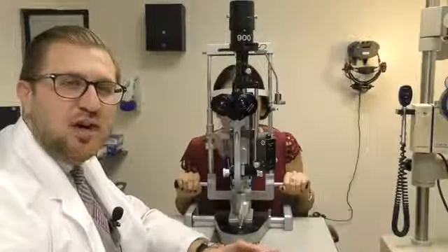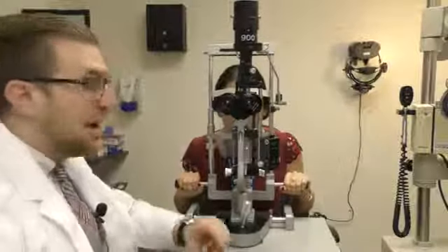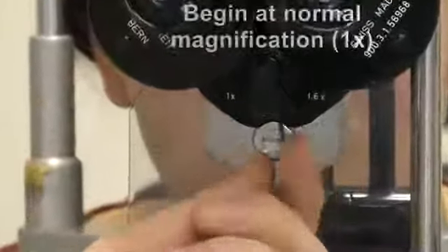So one of the most challenging parts of the slit lamp exam, I find for medical students, is how to play around with the magnification of the exam. And sometimes when they go to examine for the first time, it's on high magnification and they have trouble finding the structures of the eye. So I want you to pay attention here to how to change the magnification.